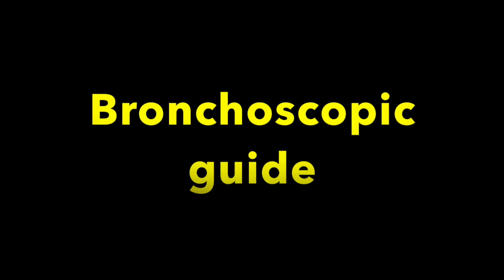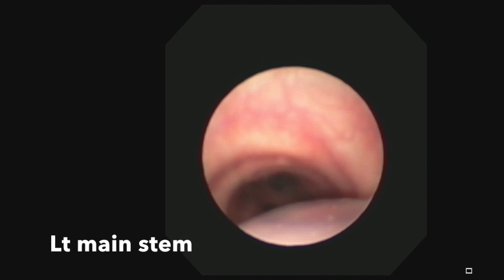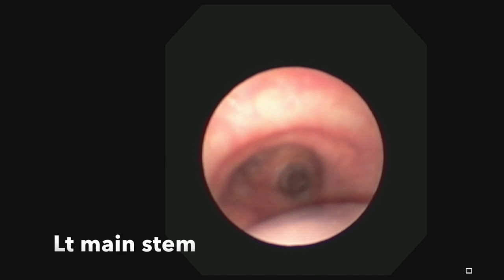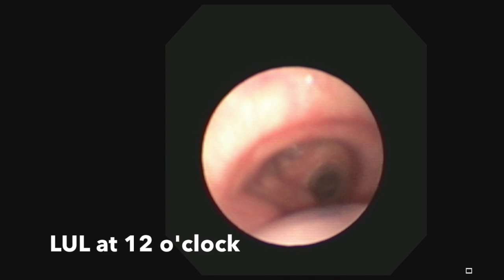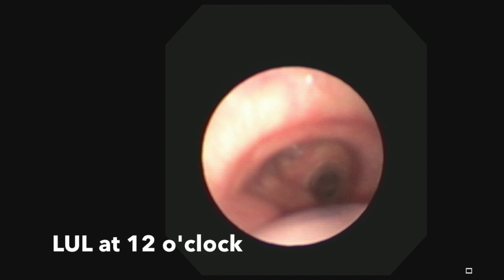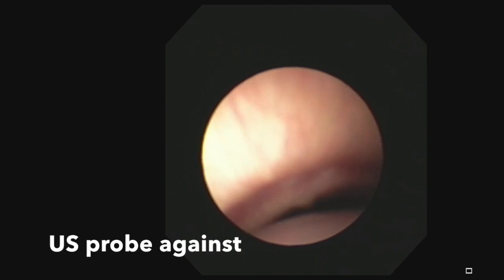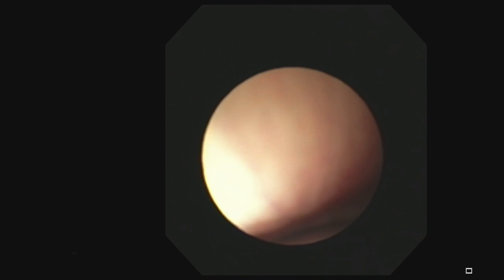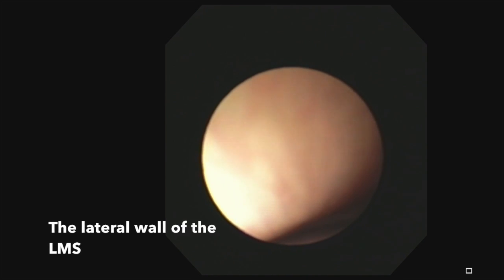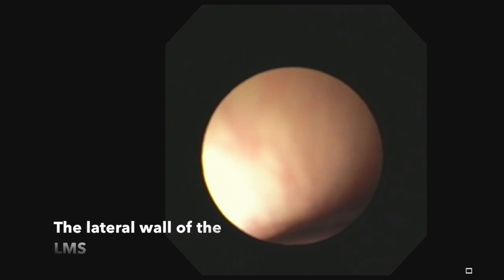By bronchoscopy, 4L will be located in the left main stem. The left upper lobe will be at 12 o'clock. The 4L view by bronchoscopy can be achieved by placing the scope against the lateral wall of the left main stem.